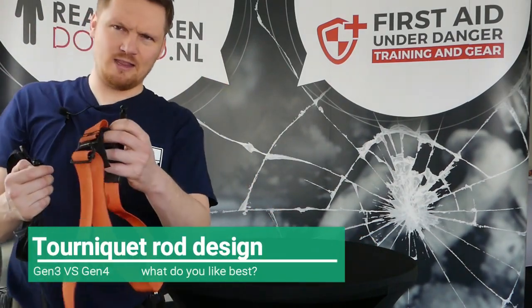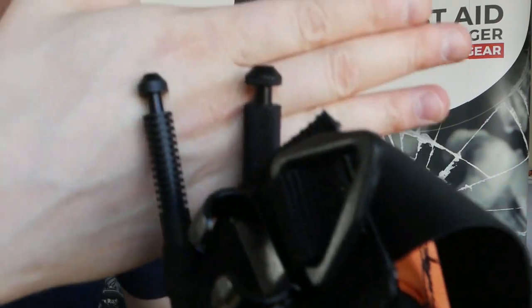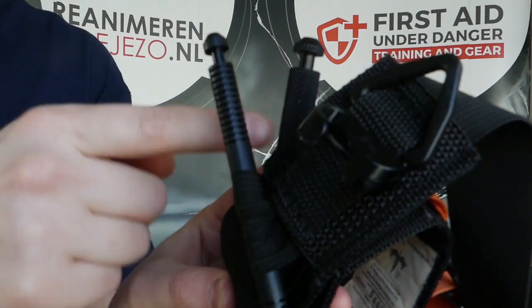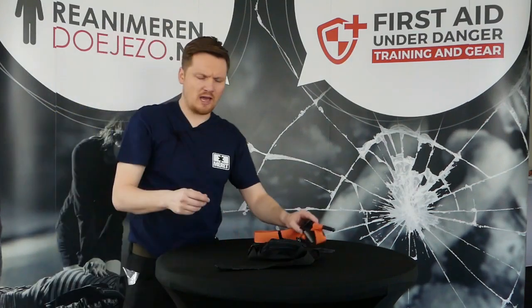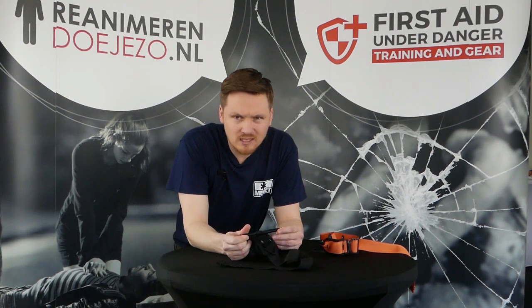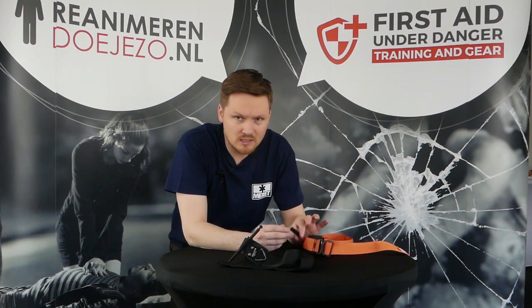Personally, I like this pattern, it feels better for your hands than this one. So there's a change in the pattern also, as you can see. This has much deeper stripes in it, and this is more like a rough surface pattern. So I don't know which one will be easier to handle with gloves. And this feels a little bit sharp. At some points it feels sharp, so let's see how easy it is to rip gloves with this tourniquet rod, for example, instead of this one.